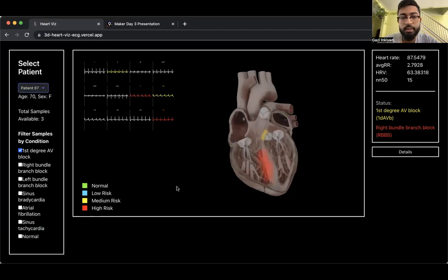We color coded the risk associated with the diagnostics here. If we have the color blue, it's associated with low risk, yellow as medium risk, and red as high risk. The reason why we selected a color code like this is because there are a lot of variabilities within the ECG data sets. Now, the model is able to diagnose the problems, and usually the model runs on a probabilistic space, which gives us outputs from 0 to 1.